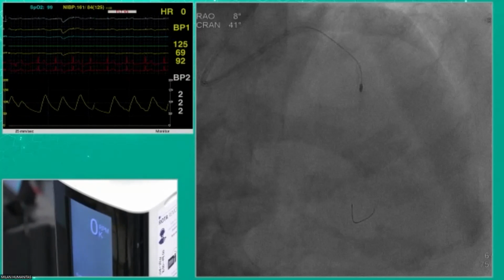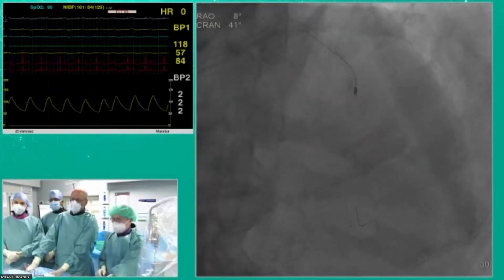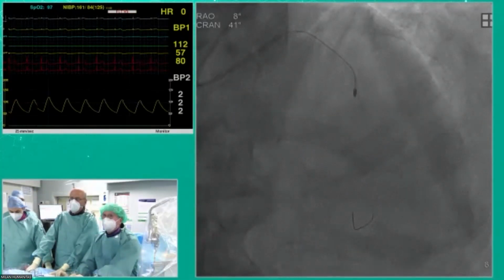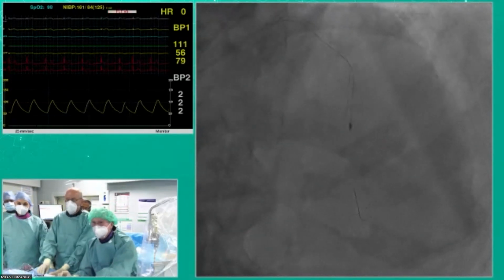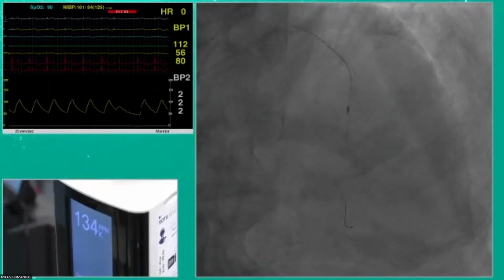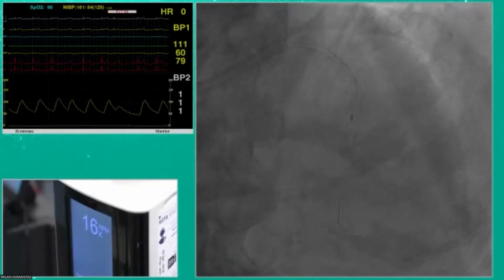So not only in India you have calcified lesions. This is a pretty solid calcific lesion. I think this is a clear indication for rotational atherectomy. Okay, ECG is fine. He has some bradycardia when I insist. Highly calcified lesion and in a challenging location. The only good thing is it's not so tortuous.